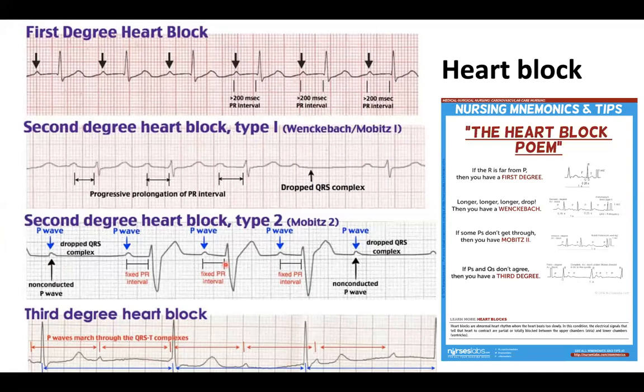So asystole means flatlining and not having a cardiac output. So this needs urgent intervention, cardiology referral, and pacing.